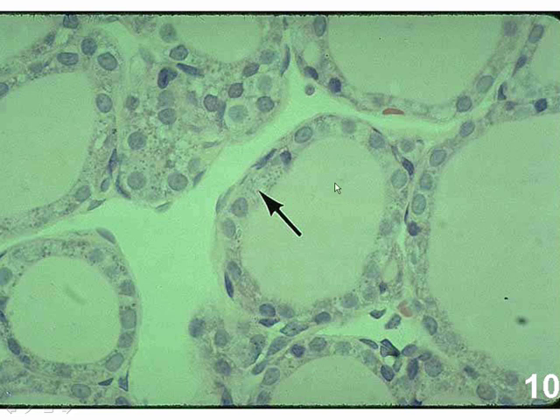It is given the generic name of colloid, which really is not specific in any sense. It's a very general descriptor. But please understand that this is material that is synthesized by the epithelium of the thyroid gland and stored within the lumen. And here we see many follicles, 1, 2, 3, 4, 5, 6, 7 follicles occur in this image.